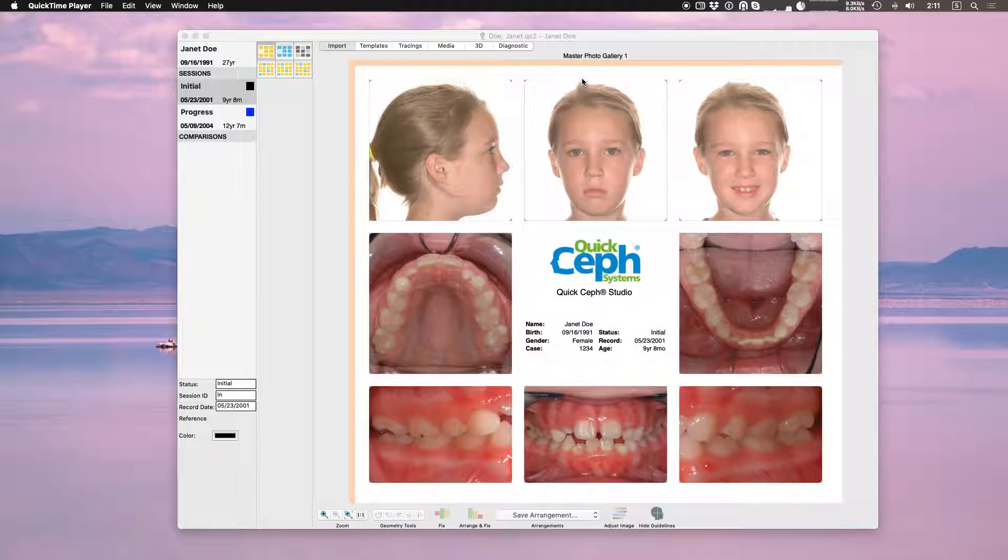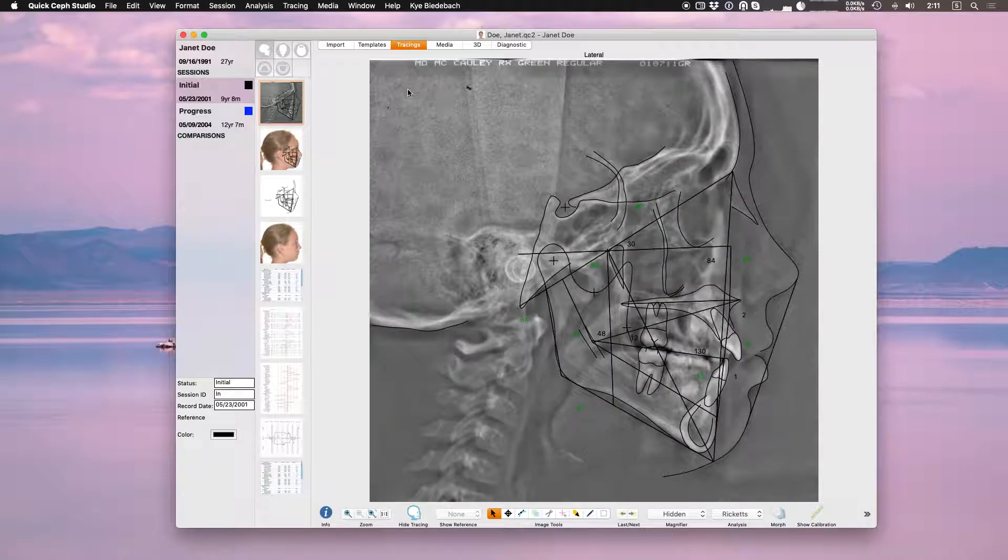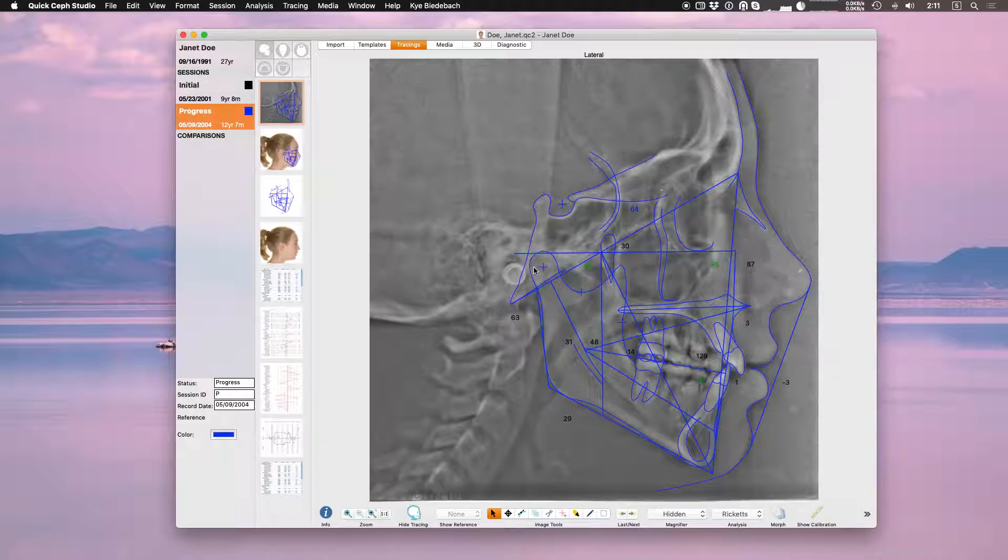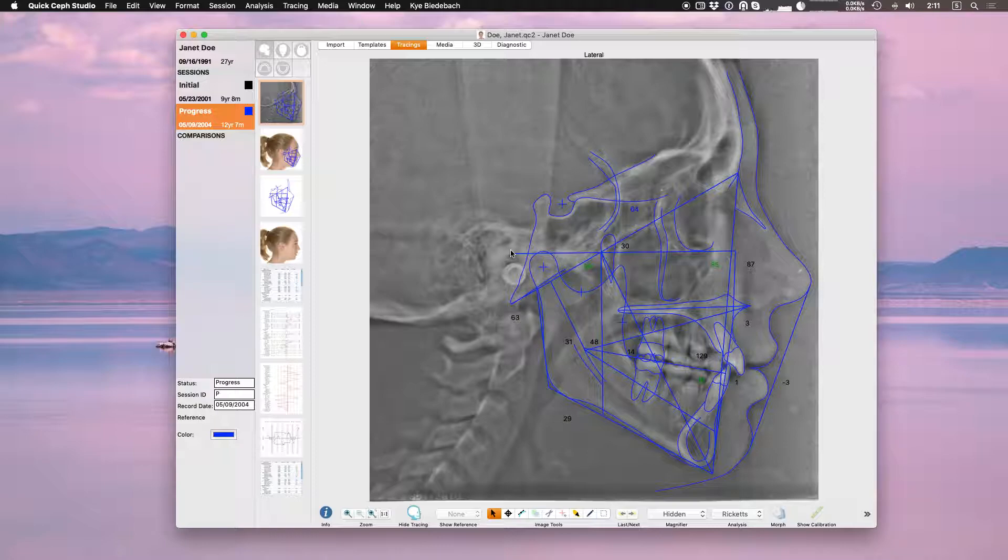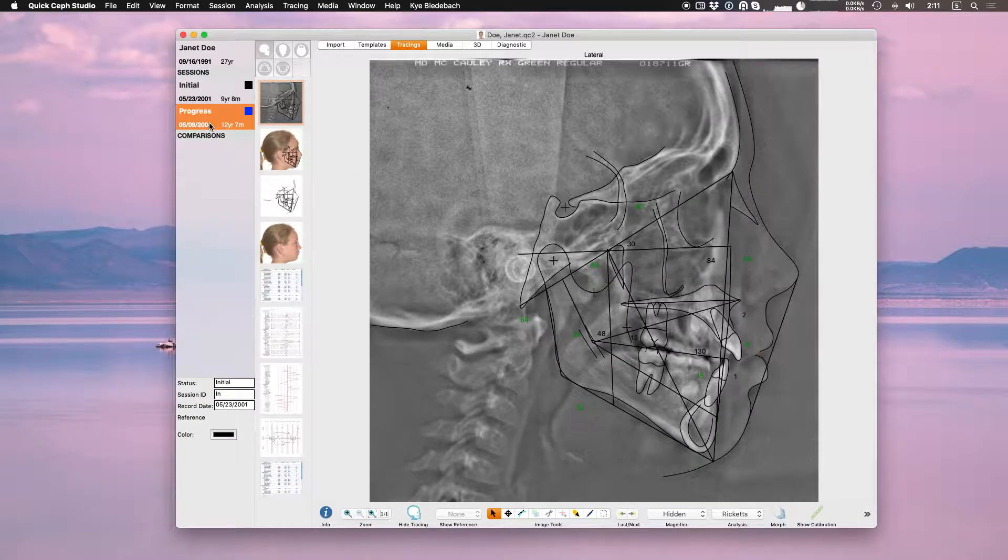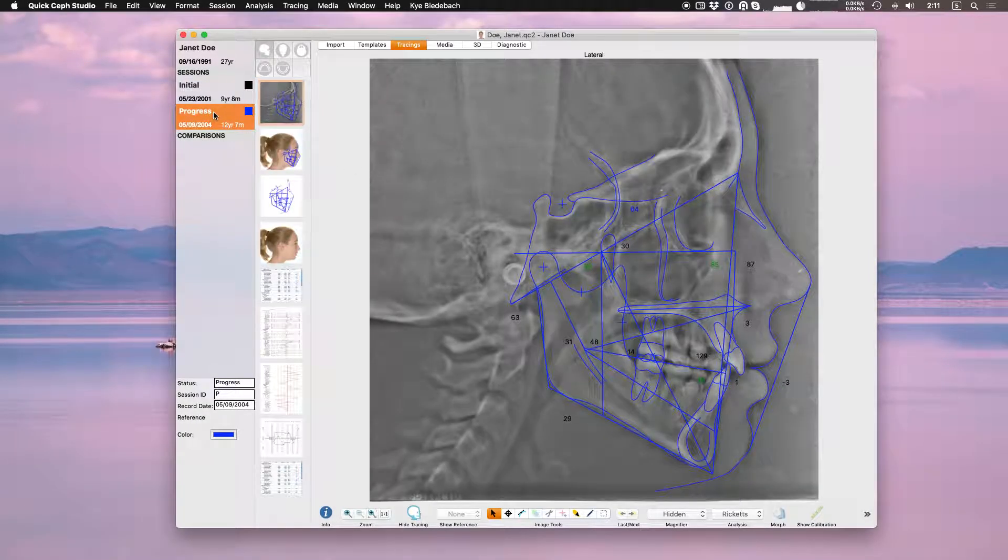To start with you need to have a patient record with at least two traced sessions. In this case you can see in my initial session there's a tracing and in my progress session there's a tracing. A superimposition has to be two trace sessions or more. Keep in mind you could have an initial session and then a treatment session. You could superimpose that as well. But in this case we have an initial and a progress.